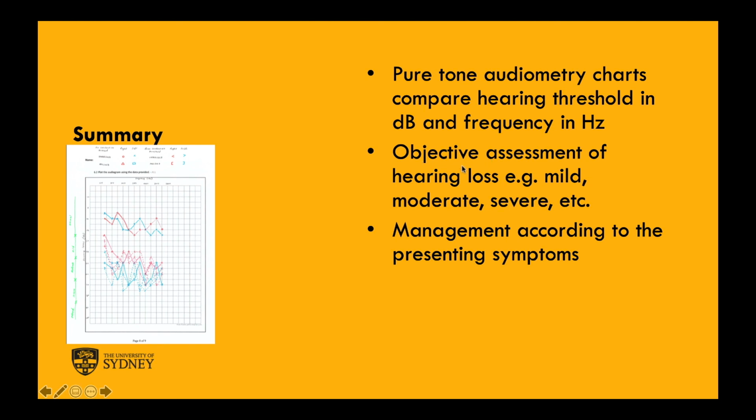It's an objective assessment of hearing loss. Fortunately, we can use it to quantify the degree of hearing loss as mild, moderate, severe, or profound. And once we get the results, we usually treat these patients according to the underlying cause of the hearing loss.